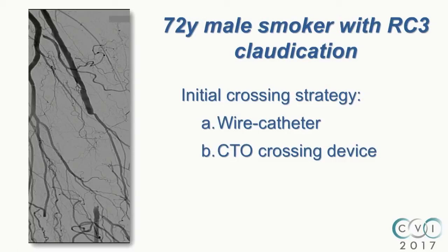I want to start off with a very quick raise of hands from my panelists. If you see this lesion with a little collateral, Erin, starting with you, would you choose a Wire-Catheter or a CTO approach as your first go? We can take a quick rapid fire here. I would go Wire-Catheter. John, I know your answer. Agree. Wire-Catheter. Ditto. Same here. Yep. Manas always agrees with me, so I will defer, so we decide how we go.